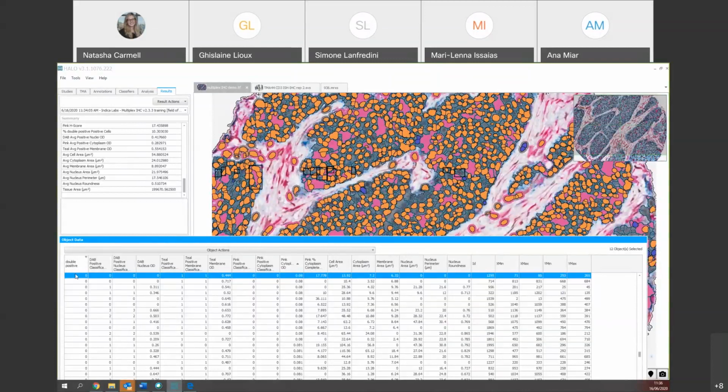So here you have your phenotype first of all. You have also the information about each of your stains. The first information would be the classification, whether it's positive. If you have them, you will have the weak, moderate, and strong categories.